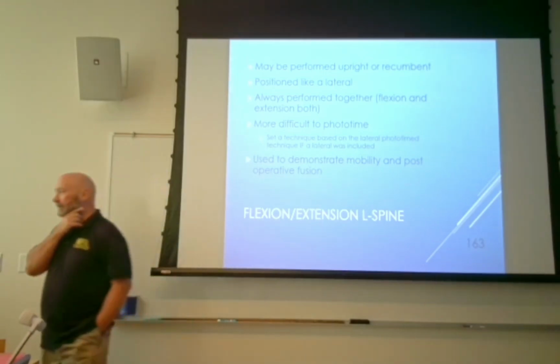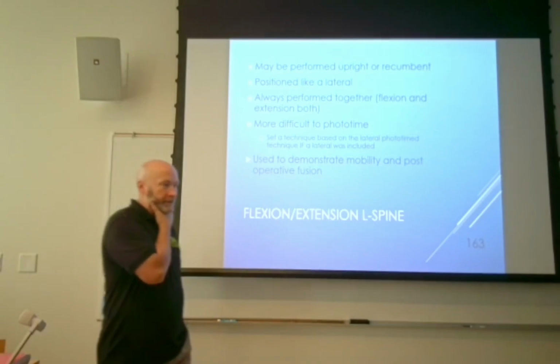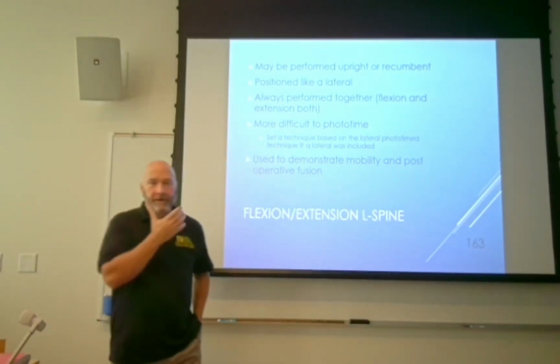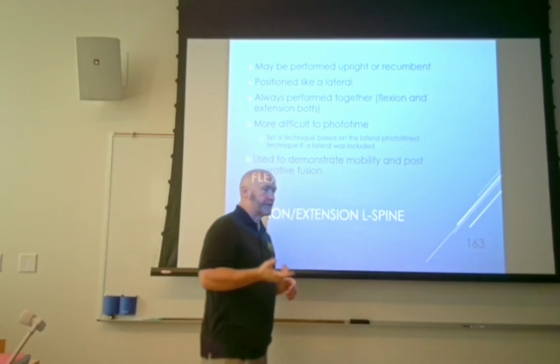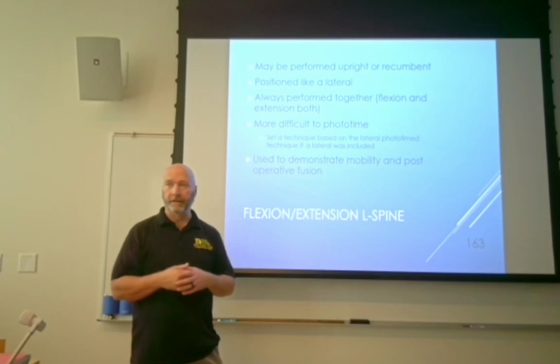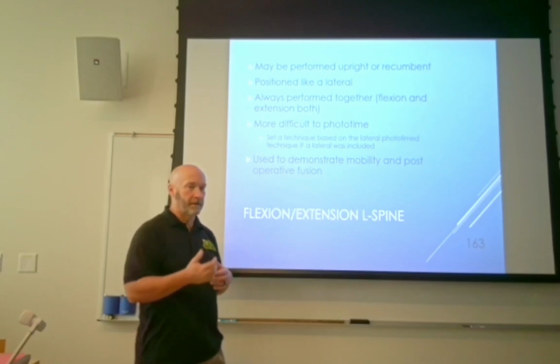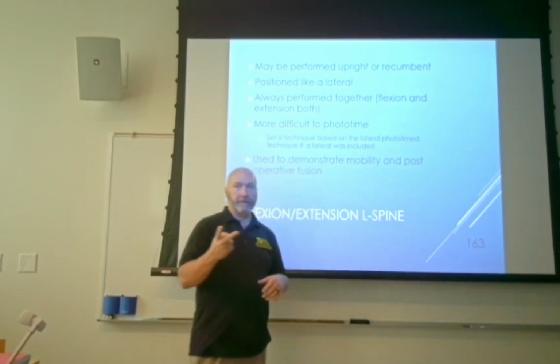So we got a couple of things that we need to talk about on lateral, some variations of lateral. And we may do these if the patient's had surgery or if the patient's got scoliosis or if they're just not showing a whole lot of mobility, if they've shown a loss of mobility. So we have two different things.